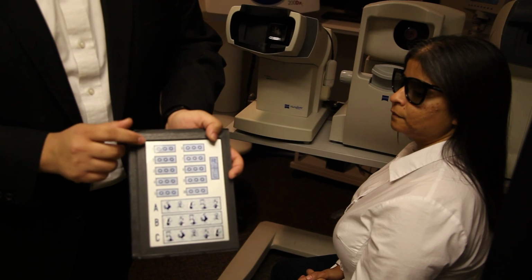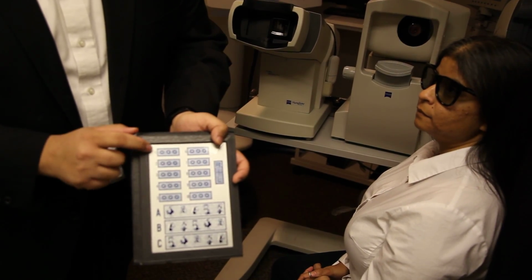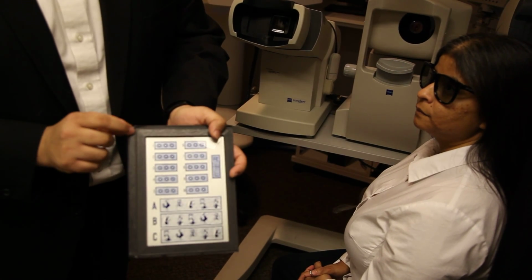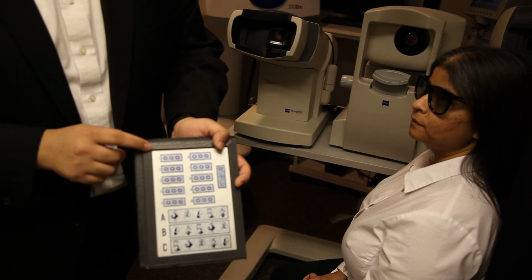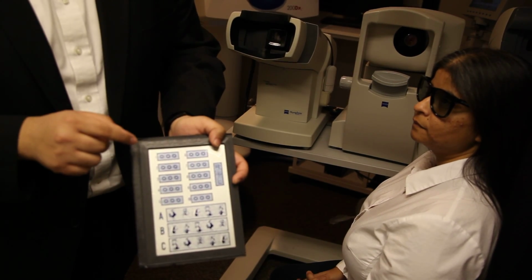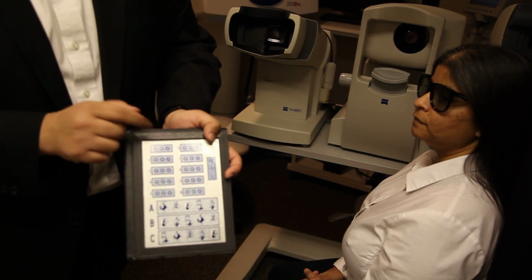And for adults, you're going to ask them to take a look at pictures 1 through 5 and let them know that in each one of the pictures, one of the circles may appear to them as if it's popping out in 3D. And if it does, you're going to want them to tell you which one it is by indicating either left, middle, or right.